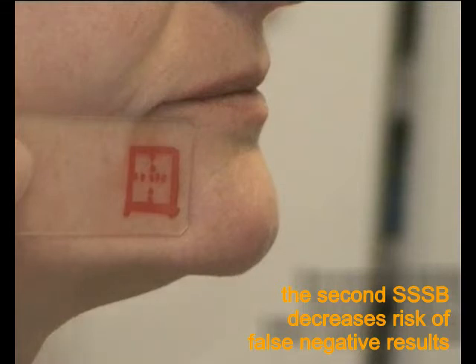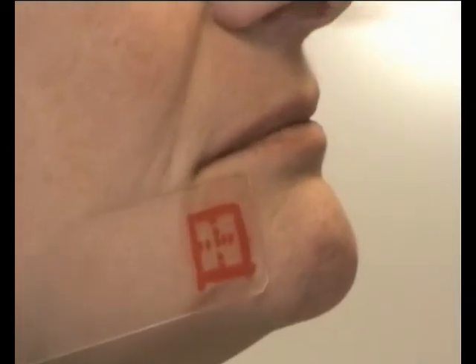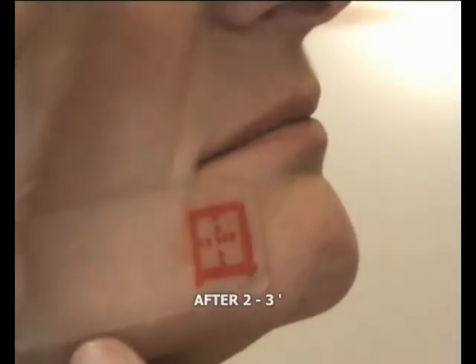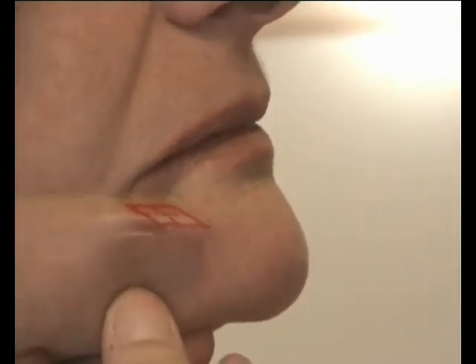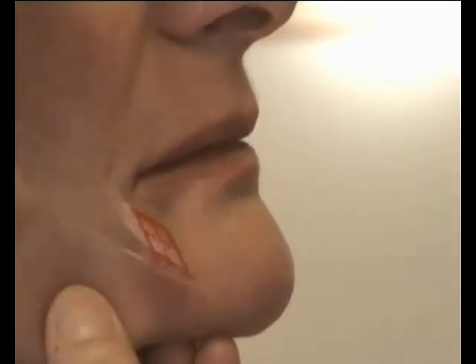After 2-3 minutes again, we remove the second one gently. Then, to alleviate the small discomfort of this biopsy, we apply a soothing cream on the place of the biopsy.